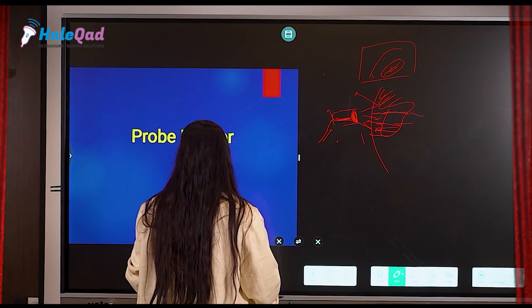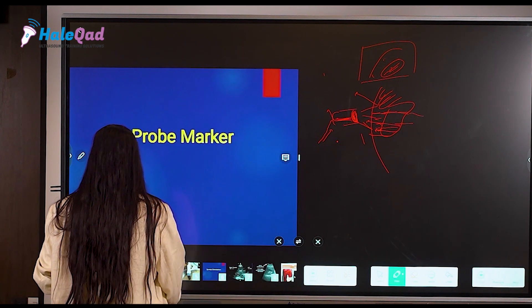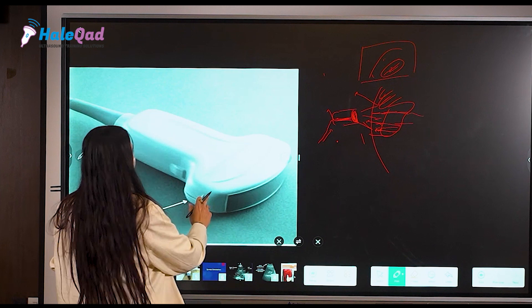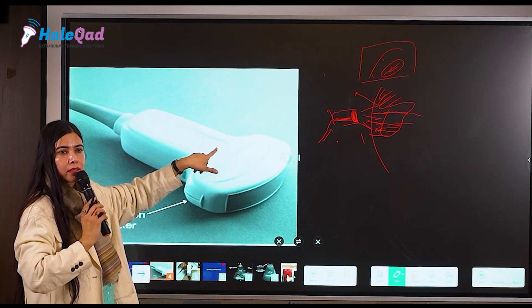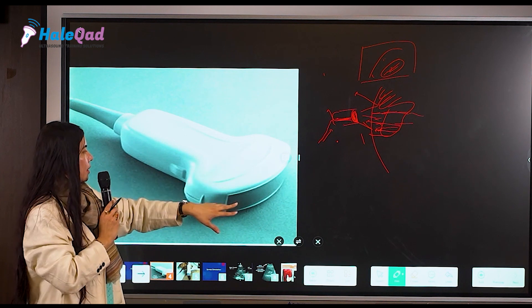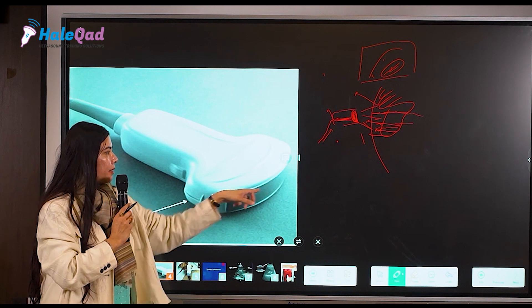The most important thing that comes first is a probe marker. This is your probe — which type of probe is this? It is convex, because the surface is convex. And this is the gray area.